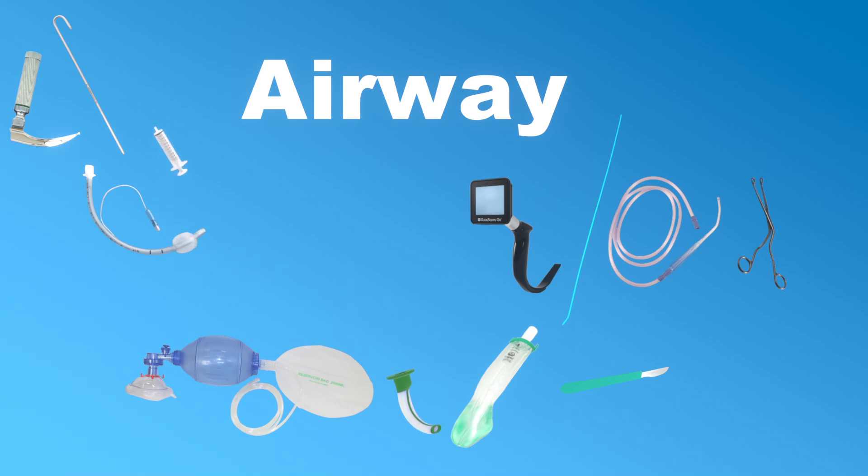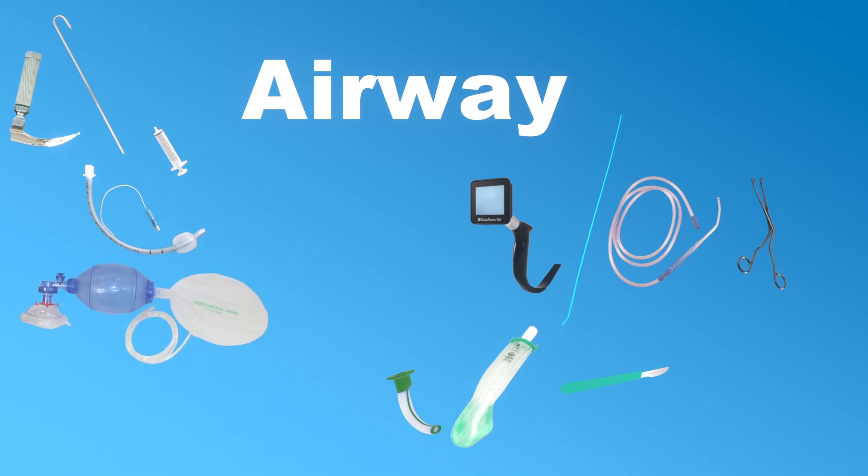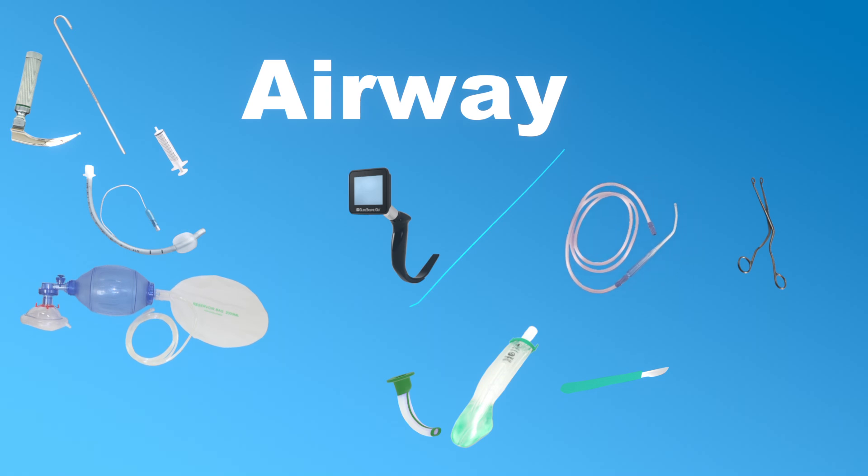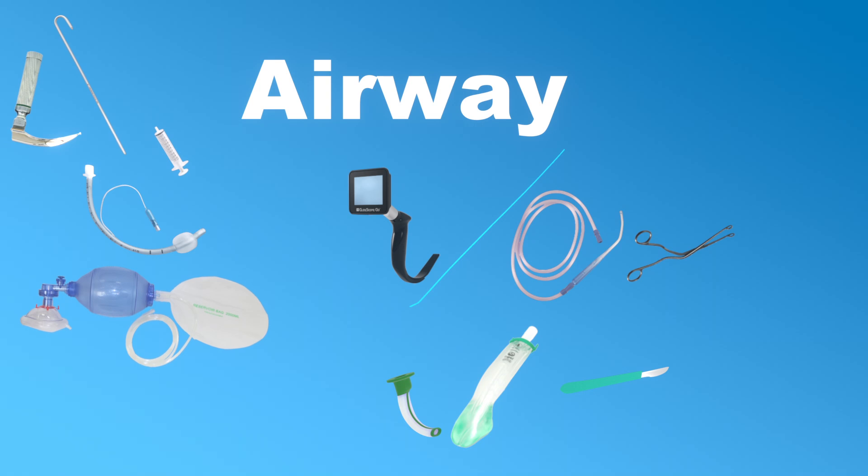In the best-case scenario this is all the airway equipment we will use, but quite often things are not so easy. So first we prepare for the situation when the vocal cords are hard to visualize and make sure a video laryngoscope and a bougie is nearby. If mucus or blood is obstructing our view we need to have a suction catheter prepared. A Magill forceps could also come in handy in those rare cases where something solid is obstructing the airway.